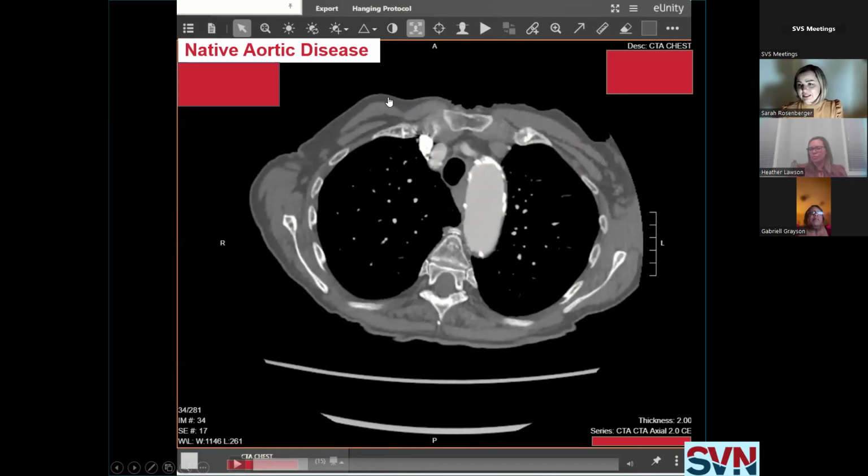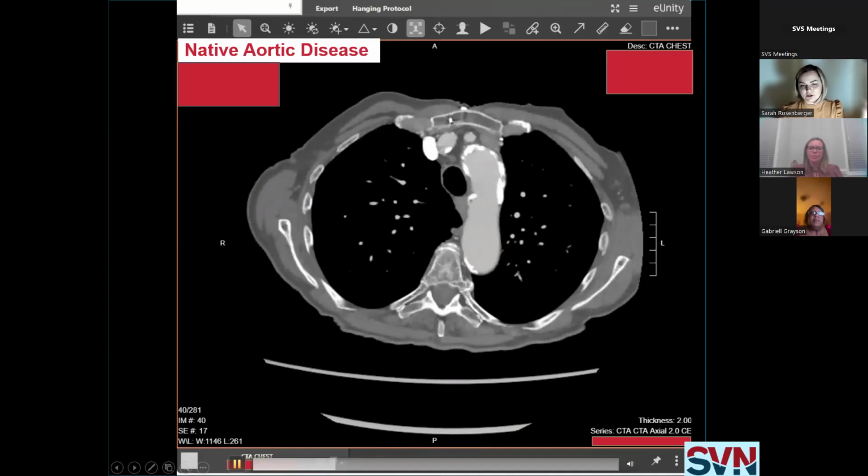You can see subcutaneous tissue is less vascularized, it's less dense than, for example, muscle, which lies underneath it. So you can see these different shades of gray. The skin is denser than the subcutaneous tissue, so you can start to see the different tissue types. But again, this penetration, this exposure that we have it set to is ideally designed to help us distinguish between firm plaque, where arterial blood flow is going, and where there might be mural thrombus or other issues.